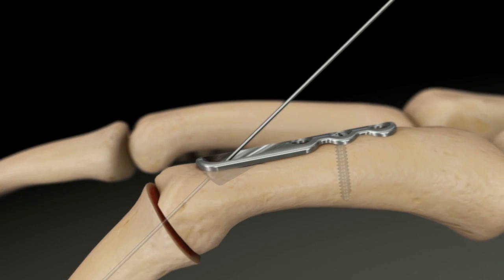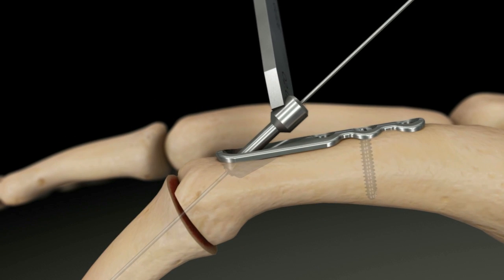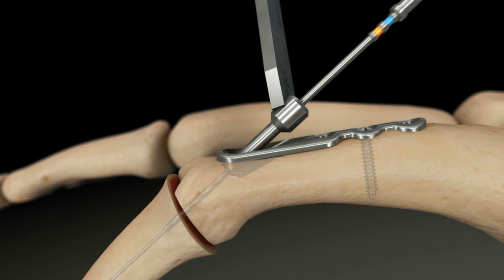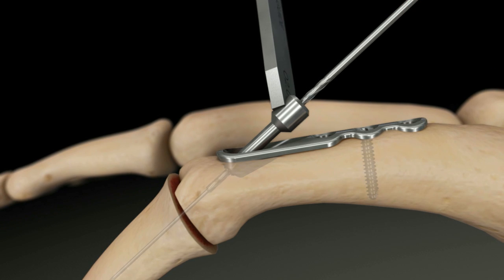For dense bone, drill over the K-wire through the transfix hole. Use a drill guide to protect the plate and ensure the ability to lock the screw.